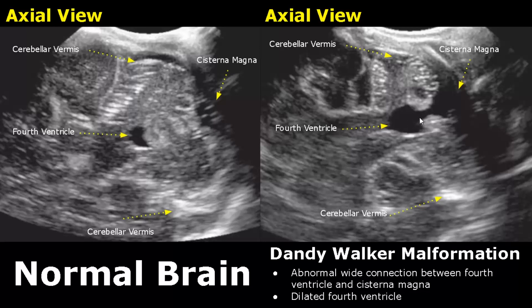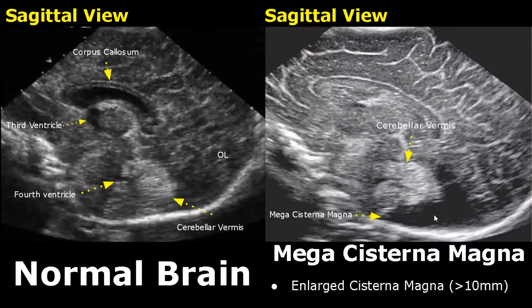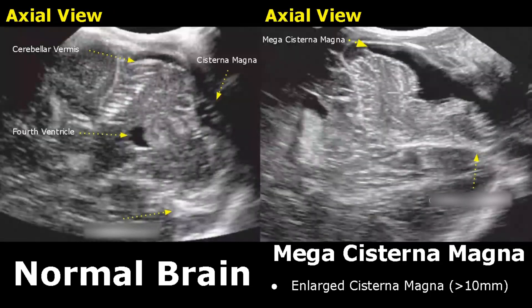In mega cisterna magna, we will see a large anechoic region behind the cerebellum. It is a normal variant, usually diagnosed when the cisterna magna measures 10 millimeters or more. Here is an axial view of mega cisterna magna — we can see a large anechoic region behind the cerebellum.